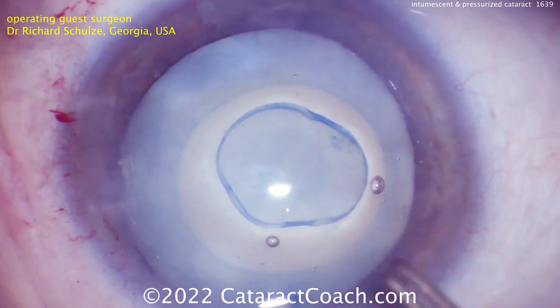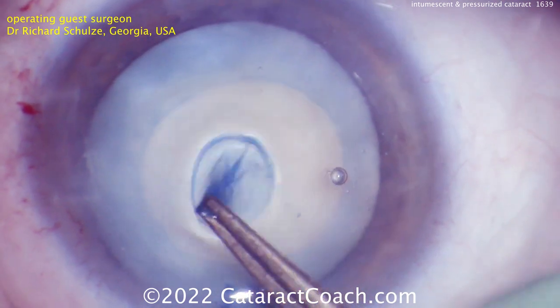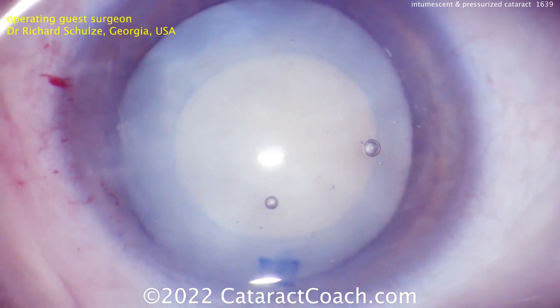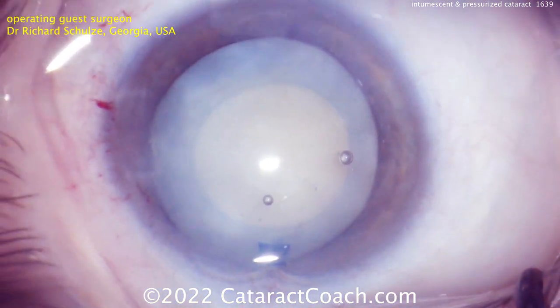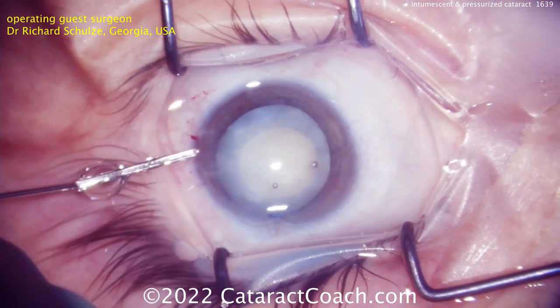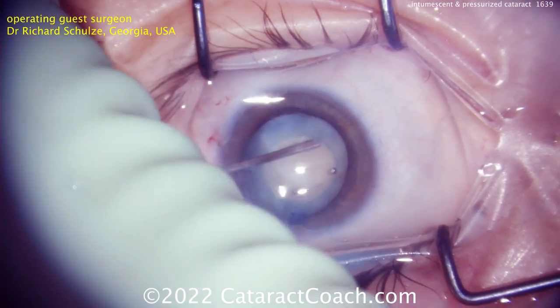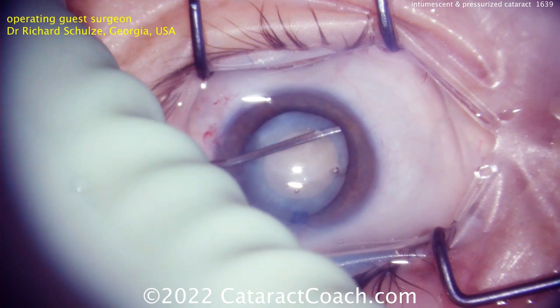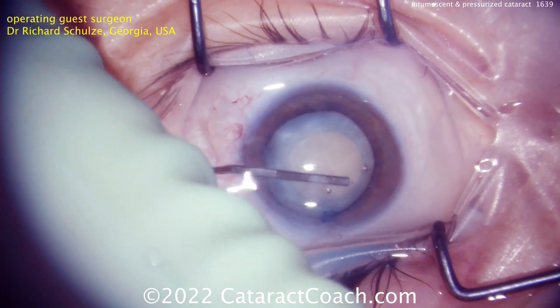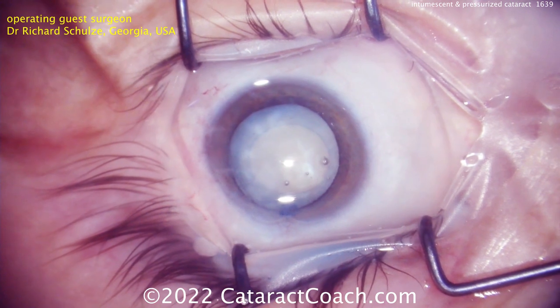In a case like this, you really don't need any hydrodissection — the liquefied lens cortex has already done that for you. Nucleus removal should be pretty easy and come out quickly. The hardest part of this whole case really was the rhexis. After a couple of cases like this, you realize you can have a beautiful rhexis every time without worrying about the risk of capsule runout or the Argentinian flag sign.